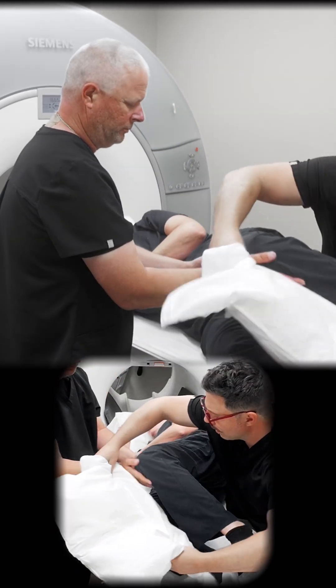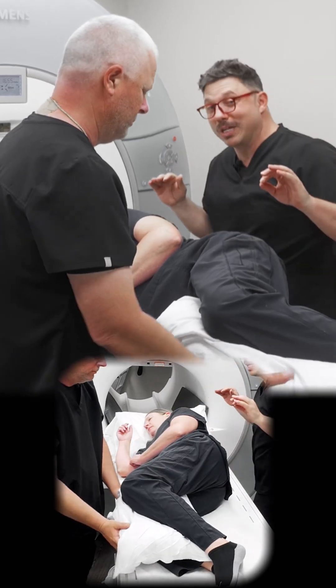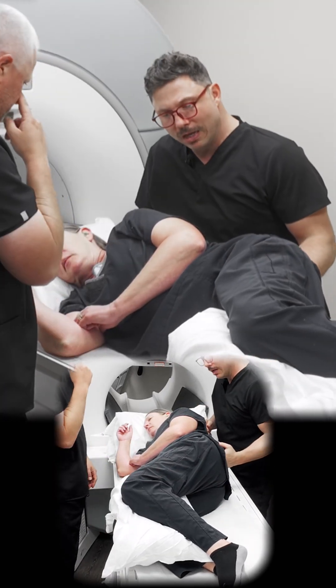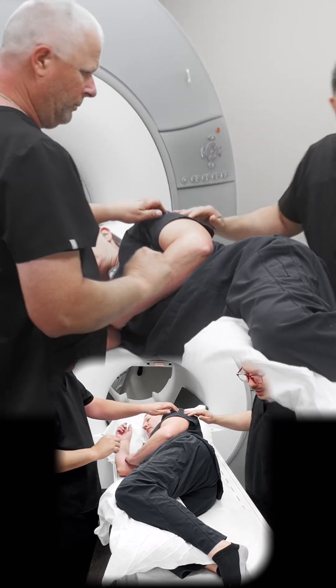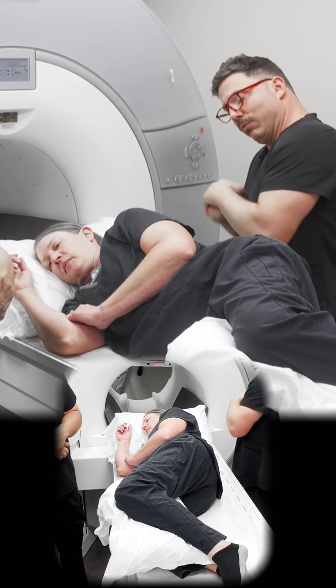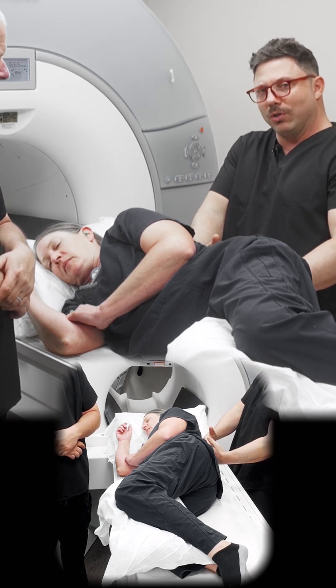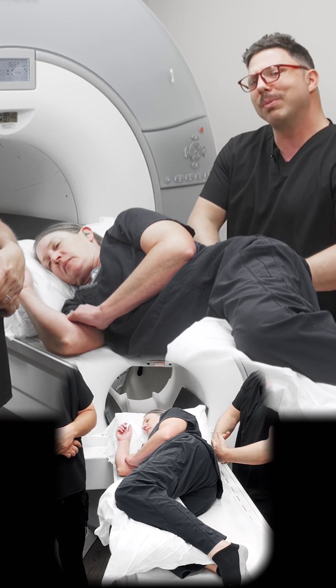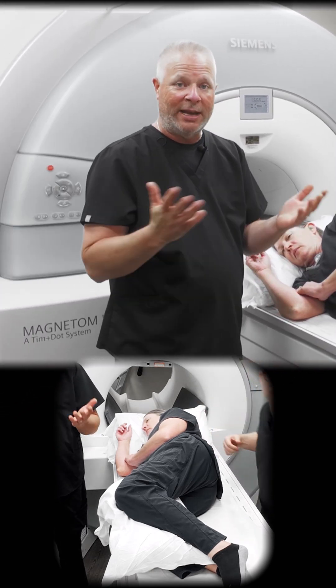For her comfort, we're gonna put a pillow between the knees so they're not resting on each other causing potential bruising. Go ahead and scoot your hip forward just a little bit — perfect — so that way we're closer to isocenter. In this method, because she's laying in right lateral decubitus on her side, to get the signal for her lumbar spine we're gonna place an 18-channel body coil right behind her.